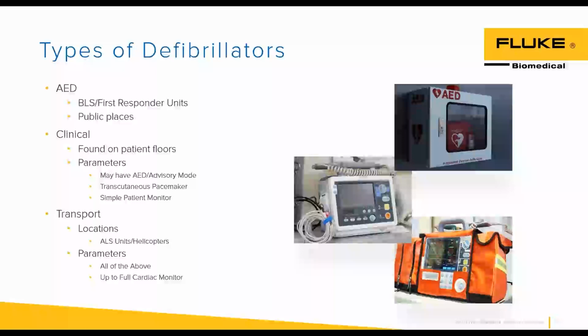So those are going to have most of the functions you'd find not only on a defibrillator, but also on a big patient monitor that you'd find in the ICU or the OR. Yeah, those can get to be a lot. Those ALS units, advanced life support units, you might have a full-blown step-down monitor on that thing.